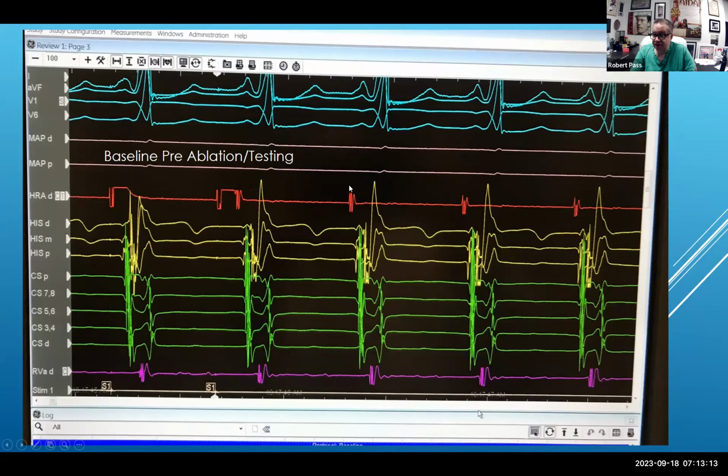But it's pretty clear, right, that this cannot represent anything to do with the ventricle because the QRS is all the way over here, okay? Now, then we have the His bundle. So we have typically in the His, an A, a His, and a V, but we don't actually see an A, His, and V. We sort of see a little A and a big V, and then you could almost imagine that there is possibly a little His in here, but everything is kind of smushed together.